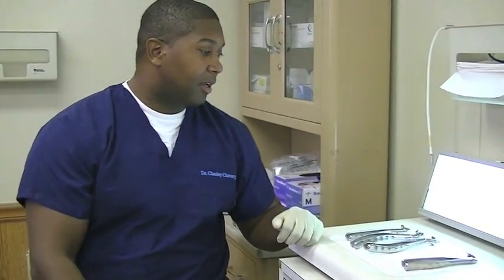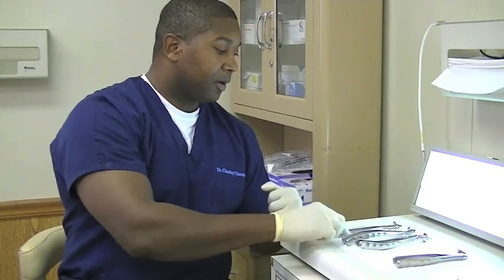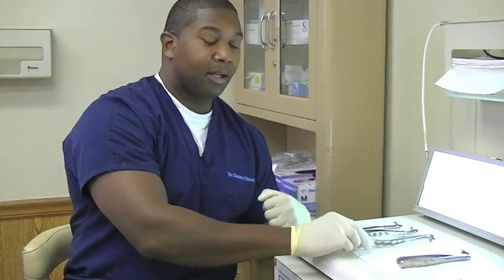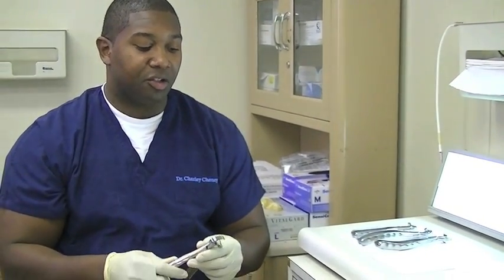The physics forceps comes in a set of four. We have our lower universal, upper anterior, upper right, and upper left. With the physics forceps, you have three components of the instrument.